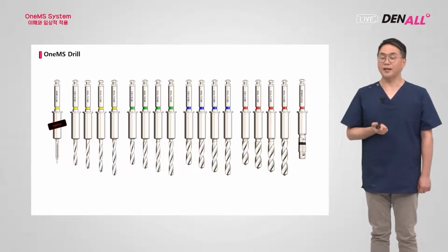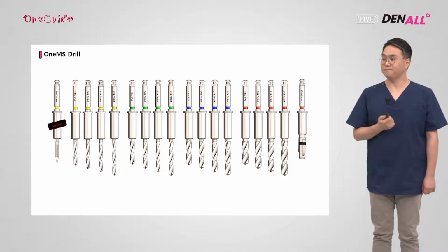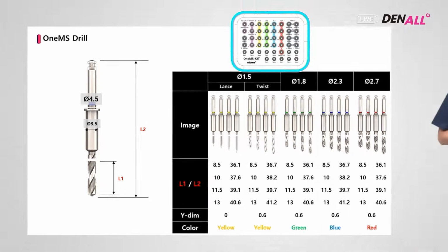And the OneMS drill, in an MS implant or two-piece type 3.0 implant, will be used as the final drill. And the MS drill looks like this. Length is 8.5 to 13 millimeters. And in the OneGuide kit, the shortest was 7.0, and you have to buy extra for 6.0. But here, it's from 8.5.